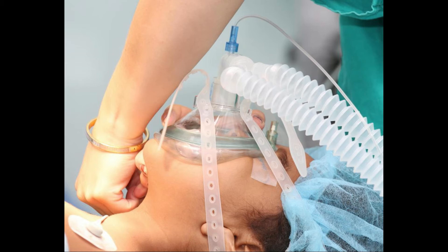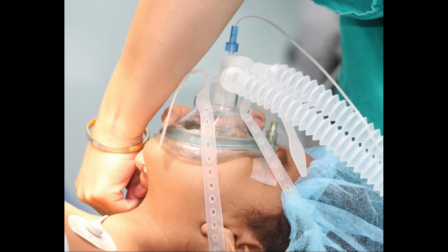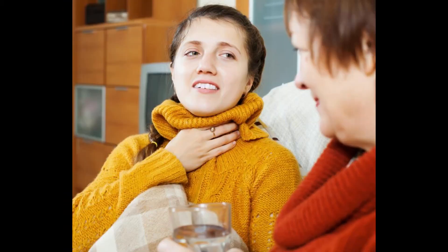Several similar products are also available and may be recommended if a care provider prefers them. Before placement of a Sengstaken-Blakemore tube, the patient may be positioned with care and sedated for comfort.